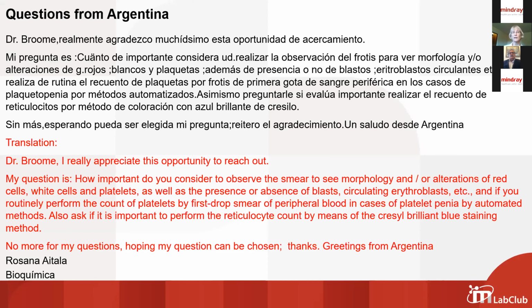I am not aware of a cutoff for a low red cell count as far as determining MCV. All of the analyzers I've used would give an MCV even with very low red counts. So I'm not sure how this would be a question. Dr. Ramon, are you aware of a problem with MCVs with low red counts?